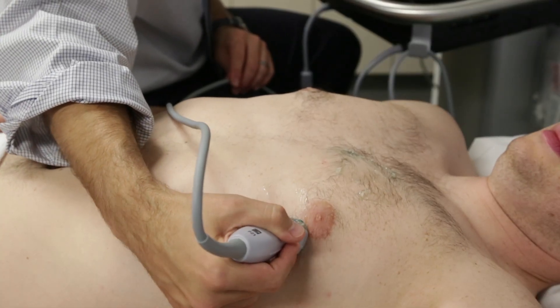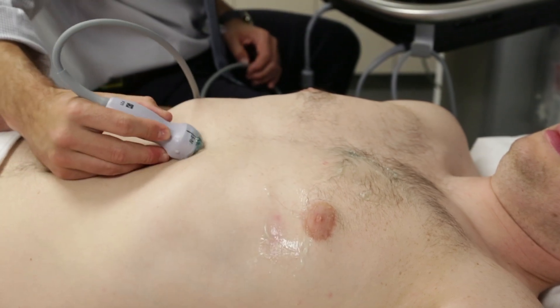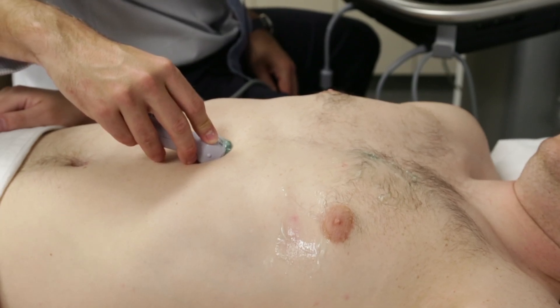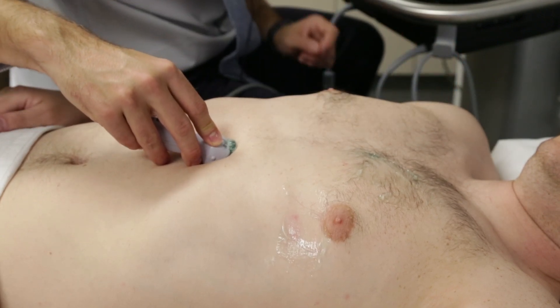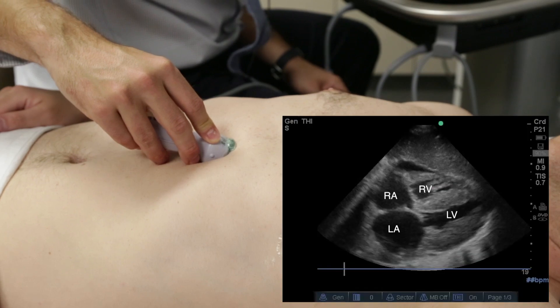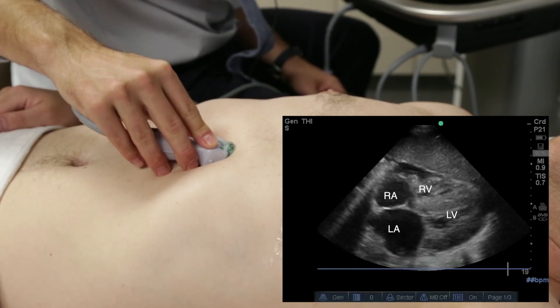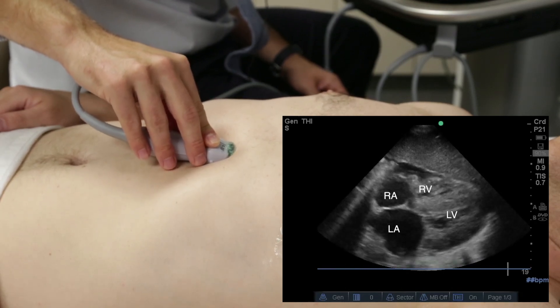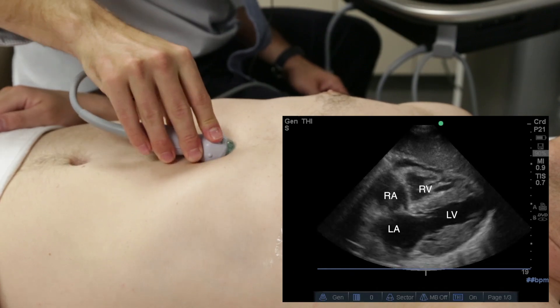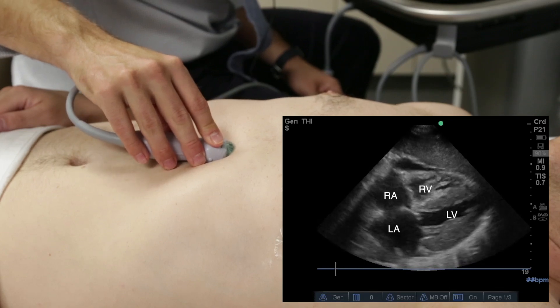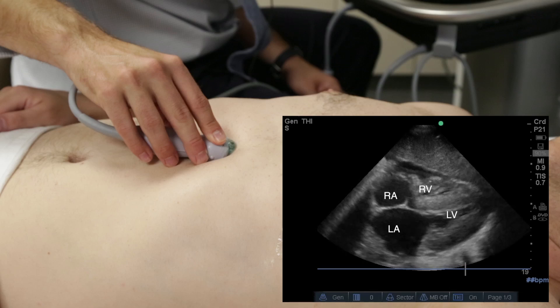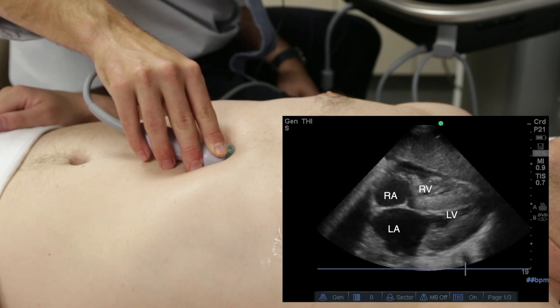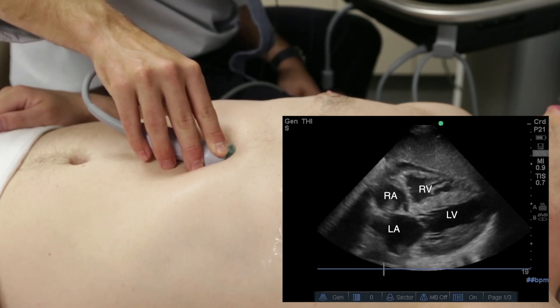We now move from the apical four-chamber view to the subcostal four-chamber view. From the apical four-chamber view, we move the probe to a midline position directly inferior to the xiphoid process. Unlike prior echo views, the probe should be flat against the patient's skin and pressed firmly down with the hand positioned on top of the probe. The probe marker is pointed toward the patient's left. This maneuver can provide a degree of discomfort and the patient should be warned. The clinician should direct the ultrasound beam inferior to the sternum and point towards the direction of the heart. Subtle tilting may be needed to acquire an optimal four-chamber view.